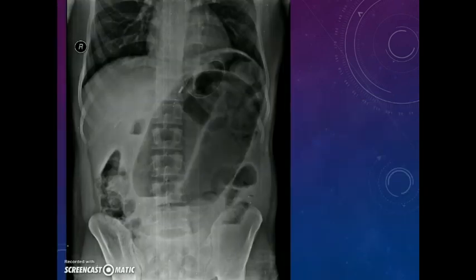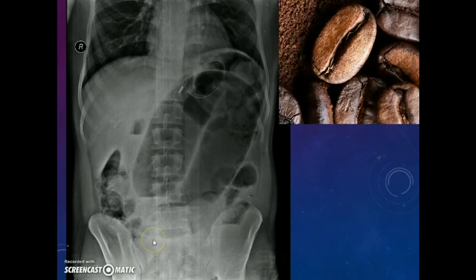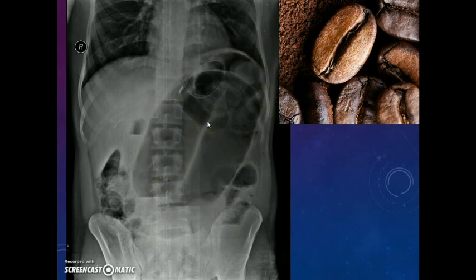What about the sigmoid colon? Unlike the ascending, descending, and transverse colon, the haustra of the sigmoid colon are not very clearly seen — they become less pronounced. So how will we know whether the sigmoid colon is dilated? This is the classical picture of sigmoid volvulus, one of the most common causes of sigmoid colon obstruction. It shows the coffee bean appearance, which is seen in the sigmoid colon. Keep this picture in mind — sigmoid volvulus, coffee bean appearance.